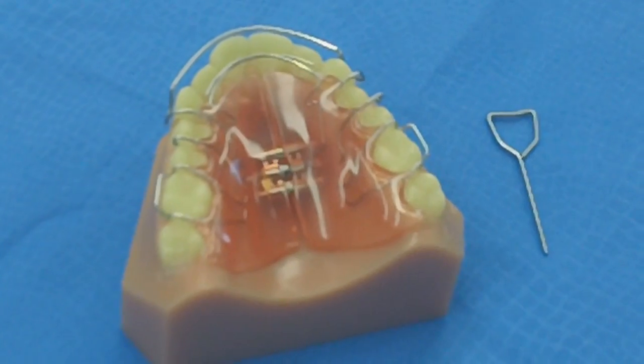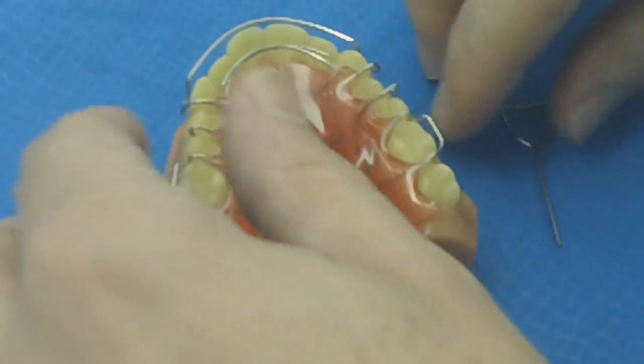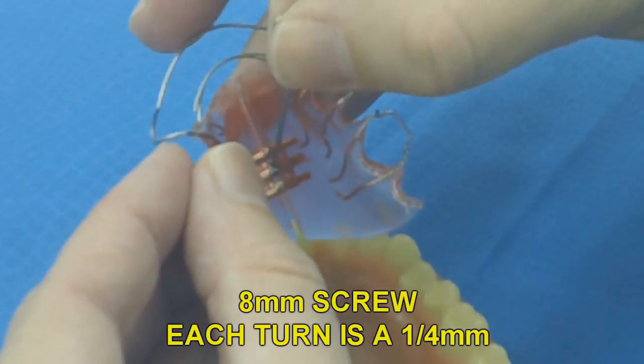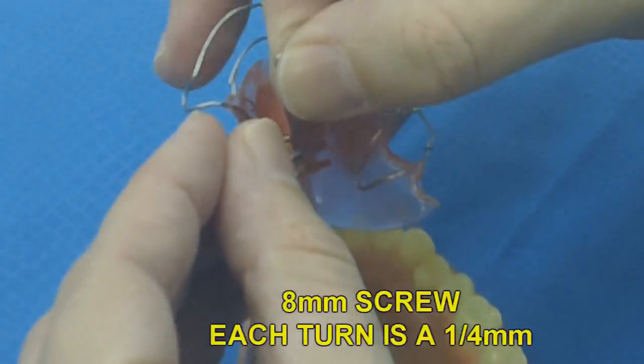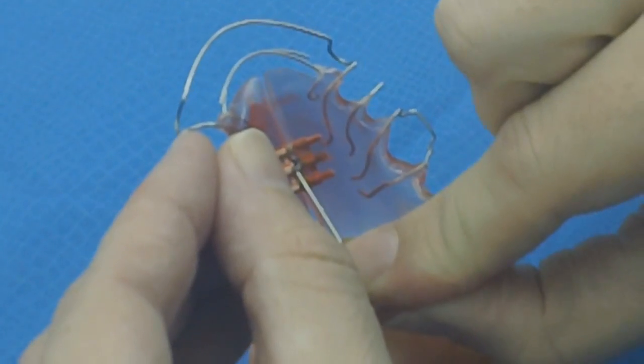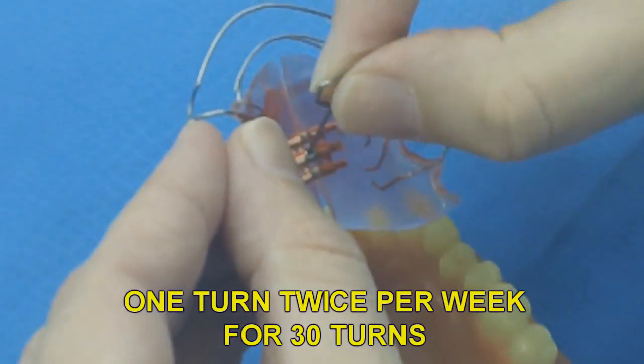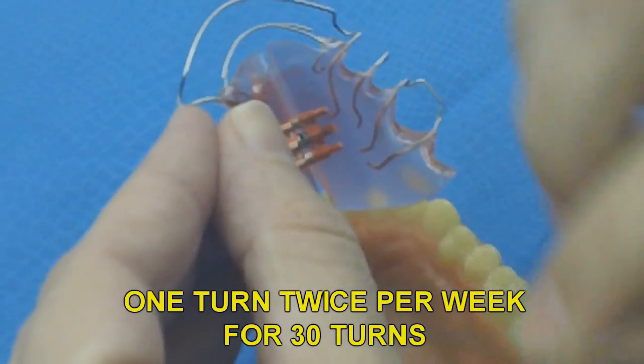The screws that we use for the Schwartz appliance are 8mm screws. Each turn is 1/4 millimeter. For most patients, you'll want to have them activate the appliance 1 turn twice a week. They can turn it about 30 times. The screw will come apart if it's turned beyond 32 times.